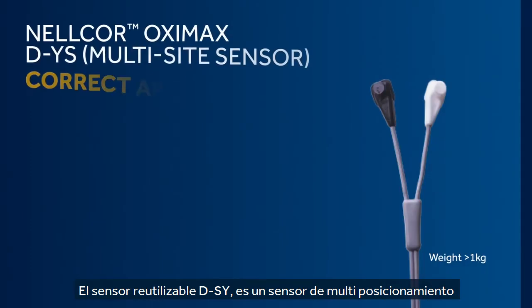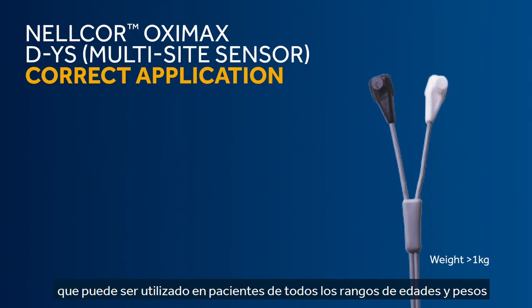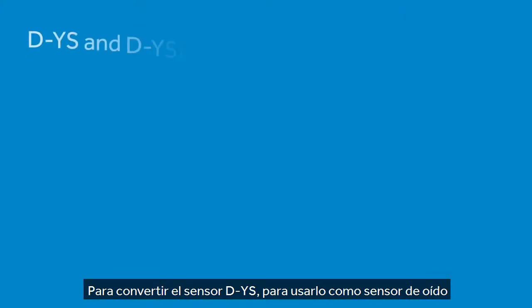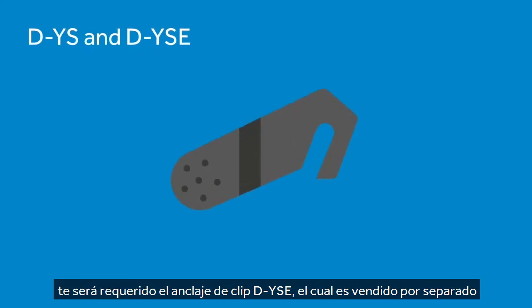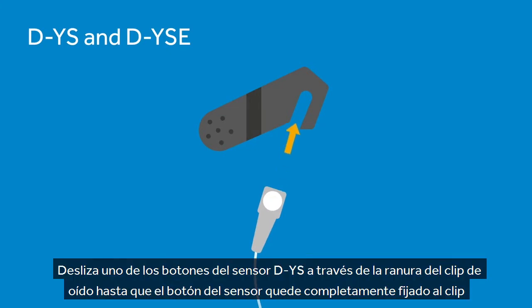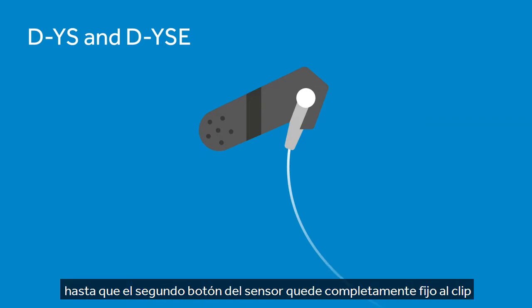The DYS reusable sensor is a multi-site sensor that can be used across all patient ages and weights when using the correct attachment. To convert the DYS for use as an ear sensor, you will require the DYSE clip attachment, which is sold separately. Slide one of the DYS sensor buttons along the ear clip slot until the sensor pad is fully engaged in the clip. Then slide the second DYS sensor button along the other ear clip slot until the second sensor pad is fully engaged in its side of the clip.